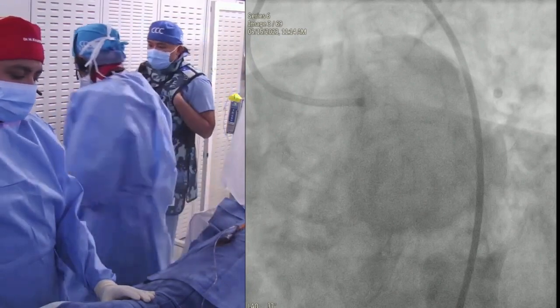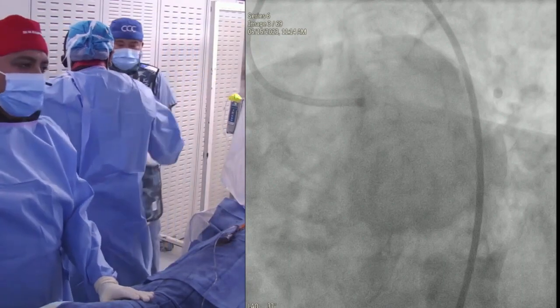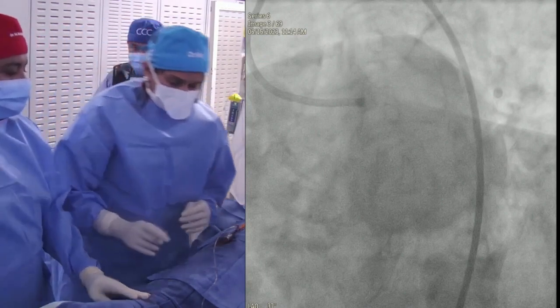So you would do provisional. You need a 7 French guide because you want to do a final inflation with 3 balloons. Okay, so that's probably not what Dr. Kinney is going to do, I promise you. Okay, Nitin, what are you going to do?